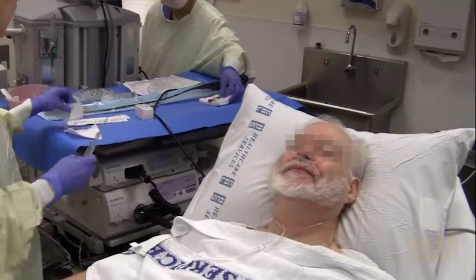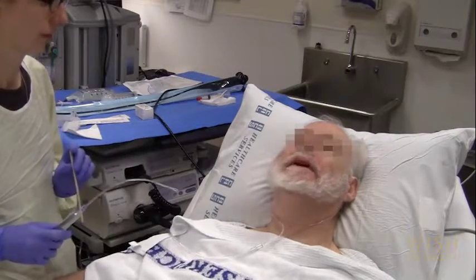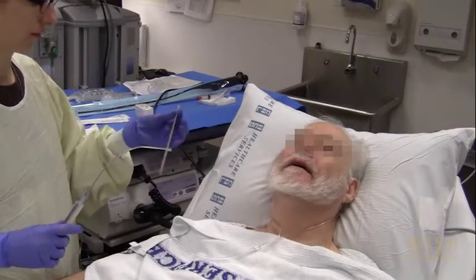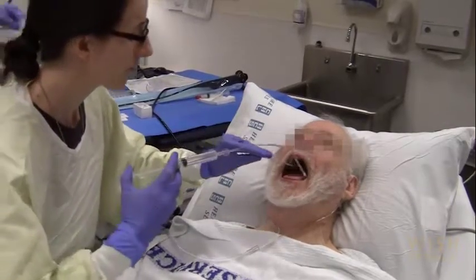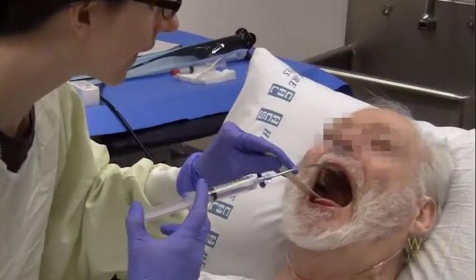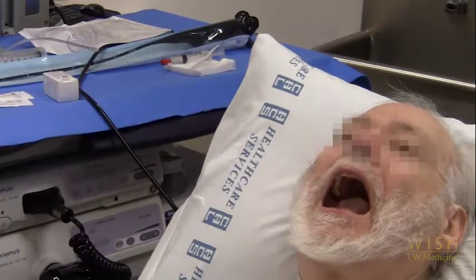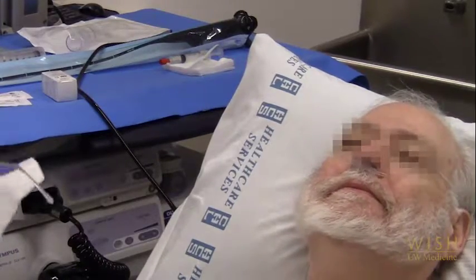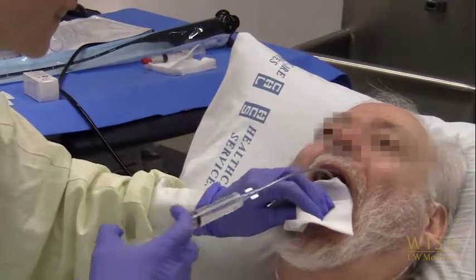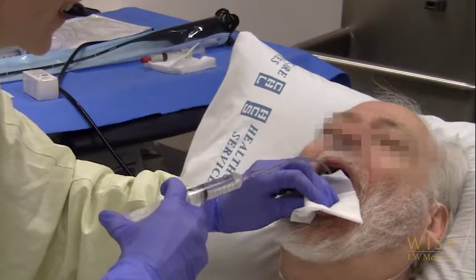An atomizer is then used to apply lidocaine to the oropharynx. The patient is asked to stick out his tongue, but it may be necessary to use a tongue depressor or to hold the tongue with a piece of gauze to get the tip of the atomizer to the back of the throat. The contents of the atomizer should be given in approximately 1 milliliter aliquots, slowly progressing through the oropharynx into the hypopharynx. This can take 5 to 10 minutes. If a patient cannot gargle well or long enough, then oropharyngeal anesthesia is achieved using the nebulizer or the atomizer.